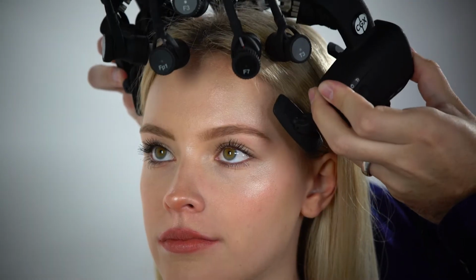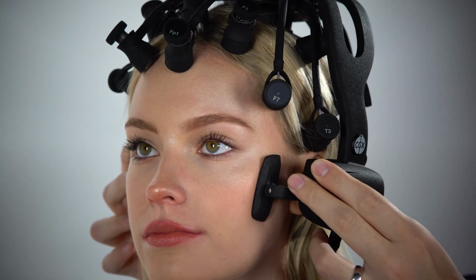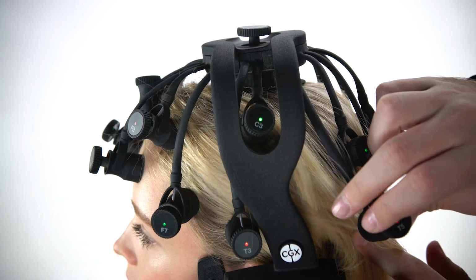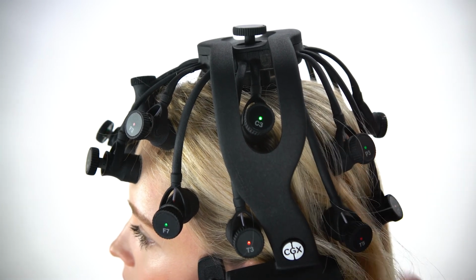Here's how to place the headset on your subject. Grasp the handles and gently pull them apart to open the headset. Check for symmetry side to side, making sure the ear pads are resting securely around the ears. Position the FP1 and FP2 sensors 1 centimeter above the eyebrows. This is important. Untangle any legs. Make sure the pods rest comfortably against the head.